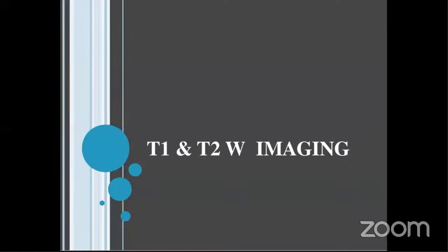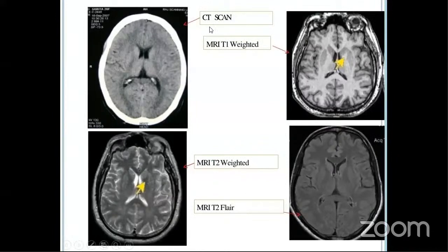Coming to our basic conventional T1 and T2 sequences. As I said, T1 is short TR, short TE, and T2 is long TR and long TE. Here, this is just again for you to get accustomed to T1 and T2 weighted images. You have MR T1 weighted images here and T2 here. As I said, for T1 and FLAIR, just see from up to down. I put both images top and bottom. In both, CSF is dark, but you see the gray-white matter difference here. You will catch it.